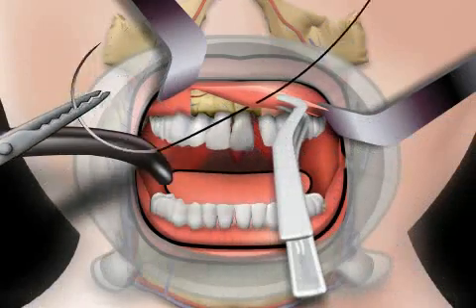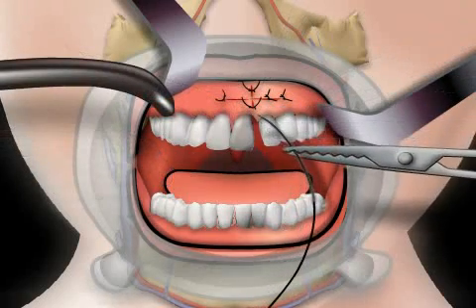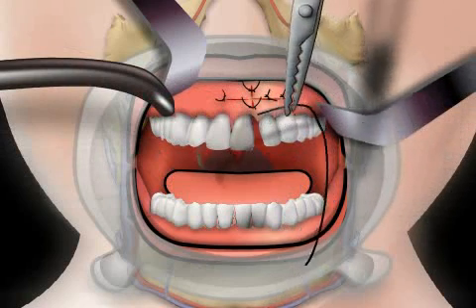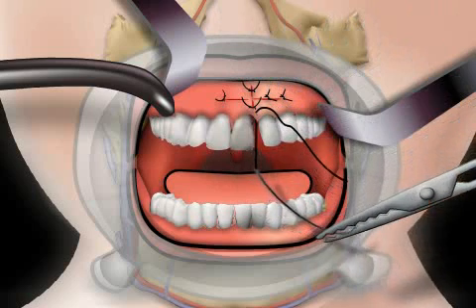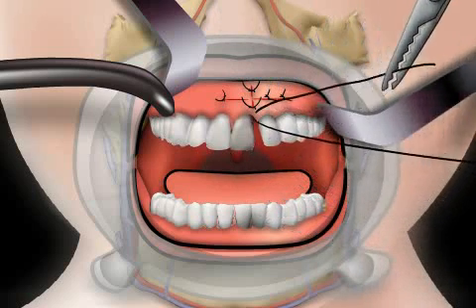To perform the suture, the needle is carefully passed between the teeth at the base of the papilla, and emerges from the gums near the palate. For the purpose of comfort, one should work with an absorbable surgical suture material, as shown in this video, because it is less prickly for the patient. Although these threads do reabsorb, they should be removed after one week for hygienic reasons.